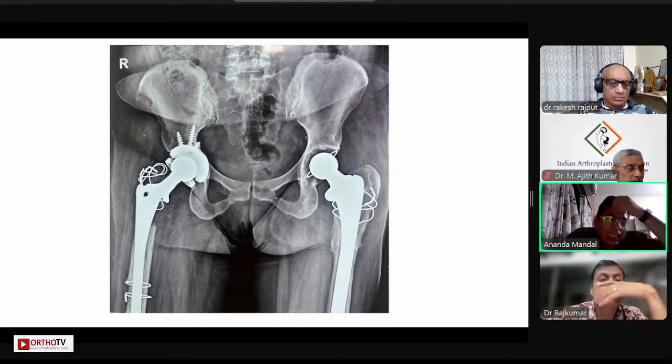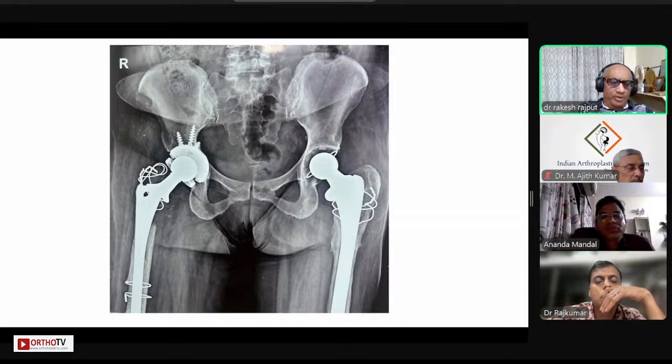I thought that I have to cut the constrained ring, but it is very difficult to cut a strong ring like this. So I detached the taper stem from the head, and after putting it into the medullary cavity, again I reduced it to the head. So it's the same stem you put in because it was cemented before, isn't it? No. The stem is different this time.